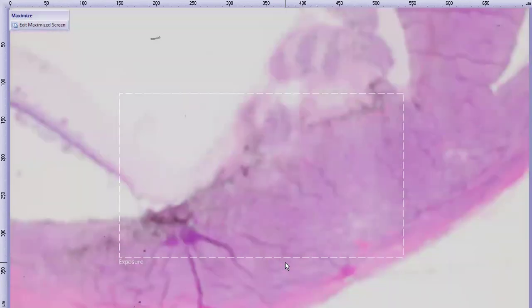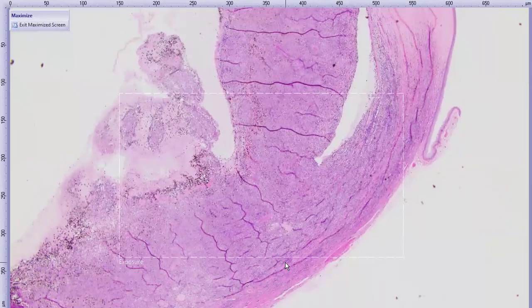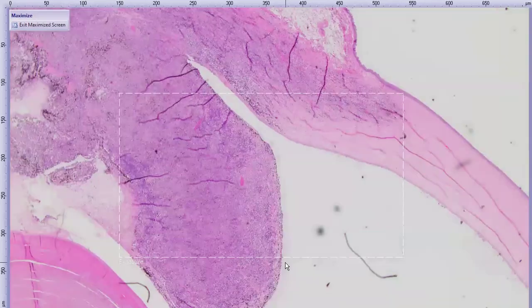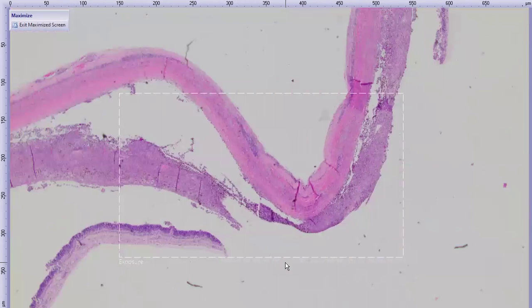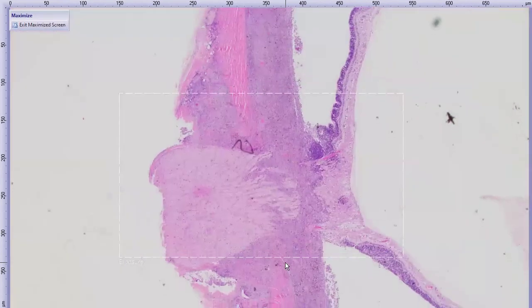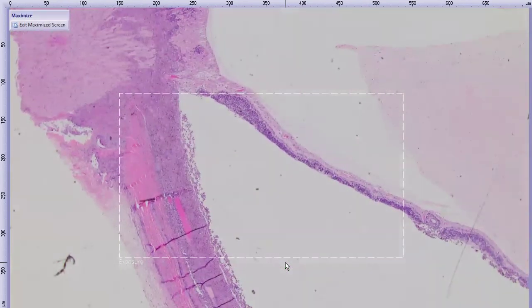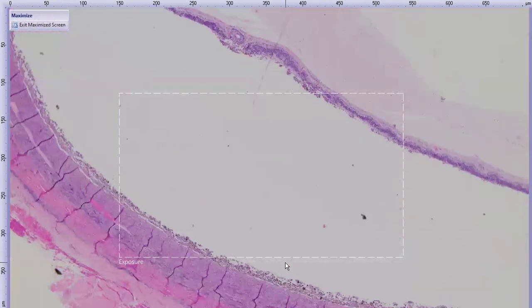And it usually presents as a very severe panuveitis. And I've pulled a case really quick here to show you for comparison. This is what we would expect to make a slam dunk diagnosis, quote unquote. So here's a patient that has a panuveitis. If we take our tour around the whole eye, it's the entire uveal tract. That inflammation essentially bleeds into surrounding structures, a little bit into the limbal sclera, a little bit into the tissue around the optic nerve, very severe. The retina is still inflamed, but relatively spared compared to the uvea at least.